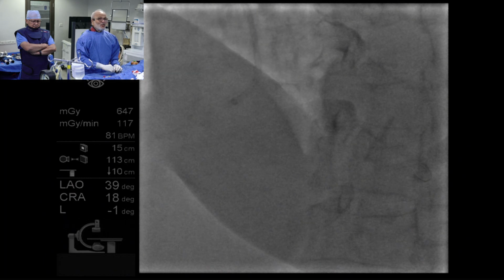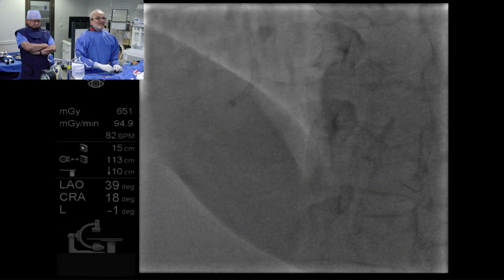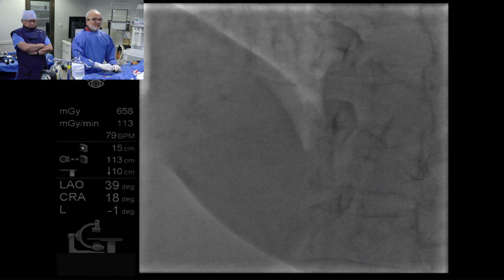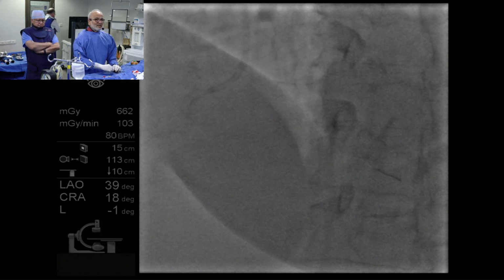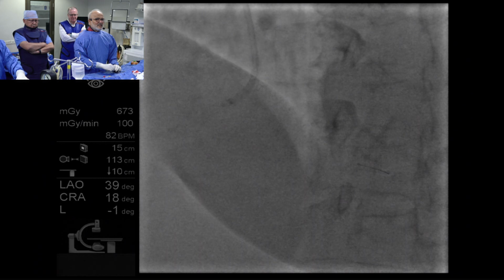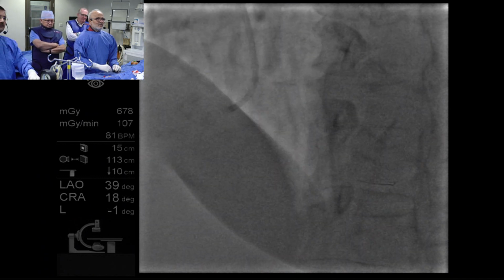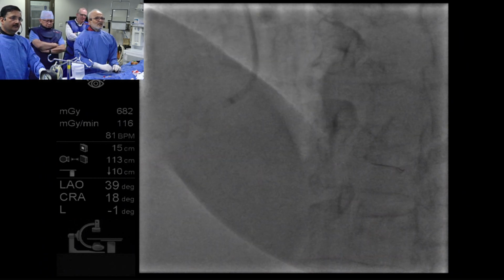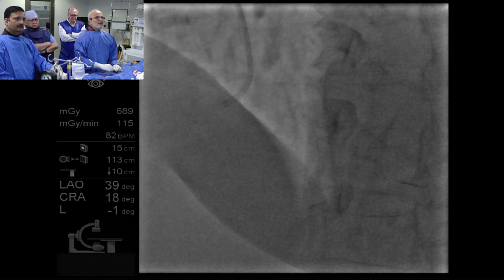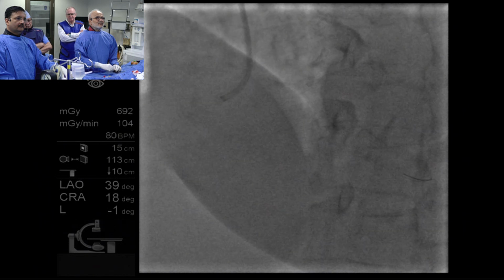Now this is a coordination. Sanjay, wire. How much I go in, Sanjay will pull it back. And now we increase our speed of going in. This coordination is so important. And we should be near now.